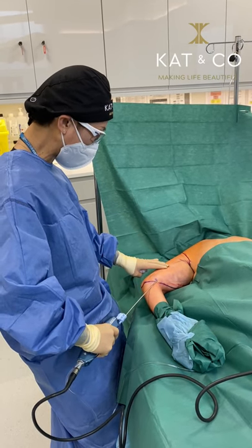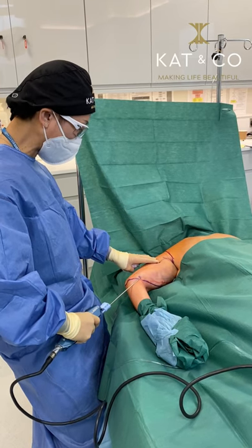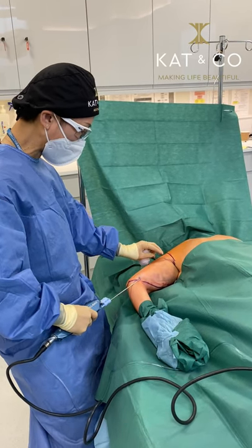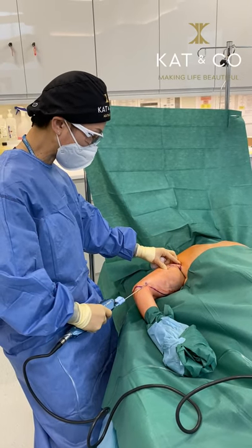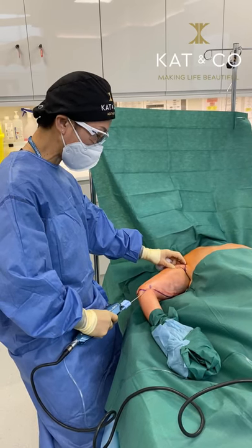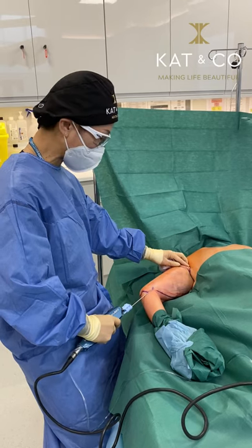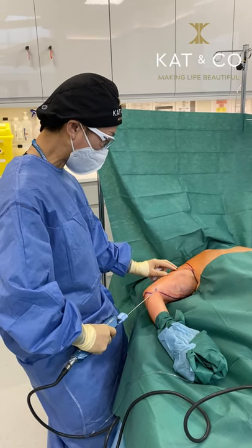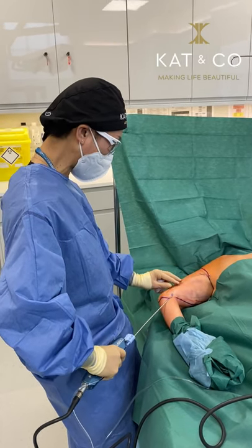This device, the power assisted device, vibrates and helps me inject the local anesthetic more evenly. And then we'll wait a good 15-20 minutes for the local anesthetic to act before we actually do the vaser liposuction.